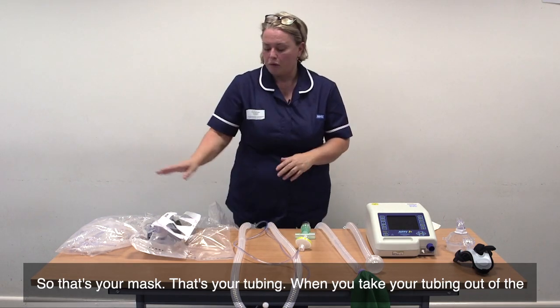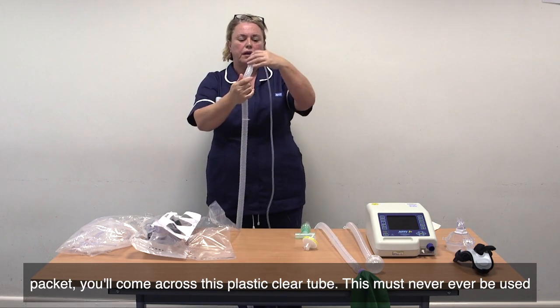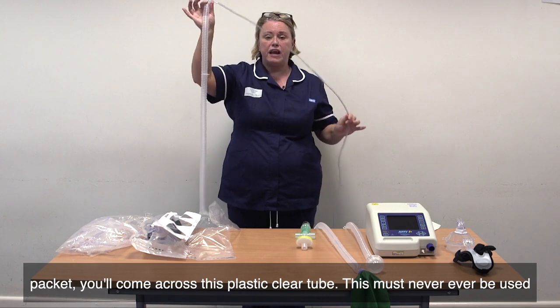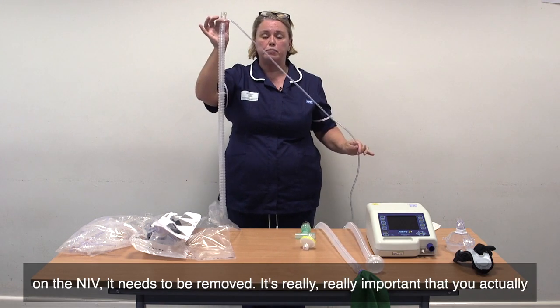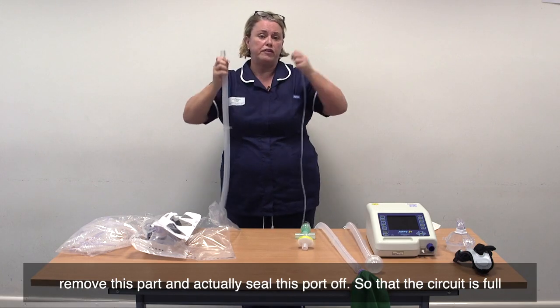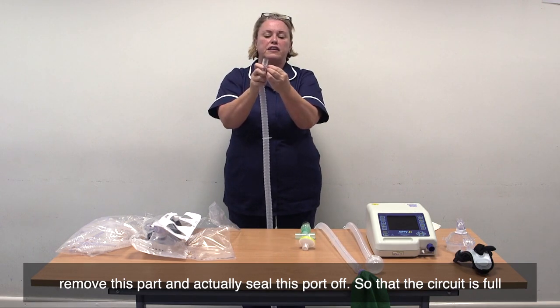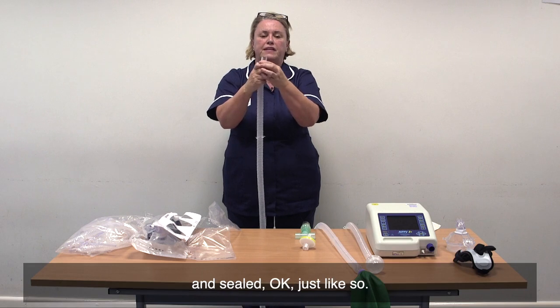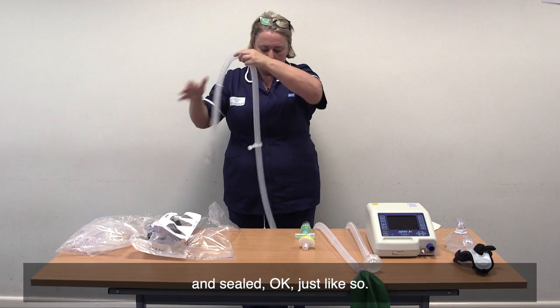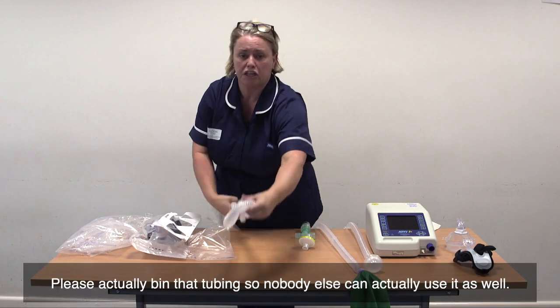So that's your mask, that's your tubing. When you take your tubing out of the packet, you'll come across this clear plastic tube. This must never, ever be used on the NIV — it needs to be removed. It's really important that you actually remove this part and seal this part off so that the circuit is full and sealed. Please bin that tubing so nobody else can use it as well.